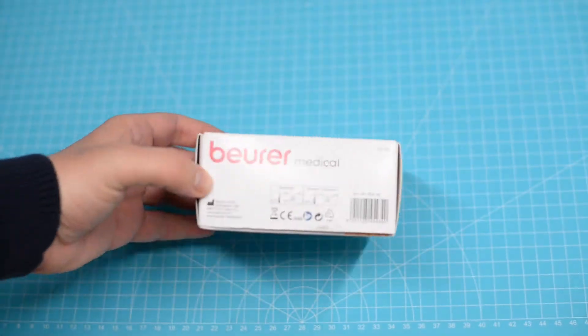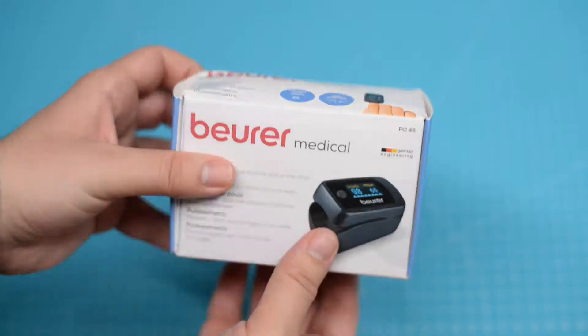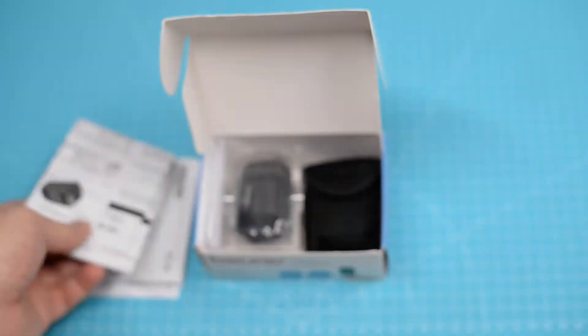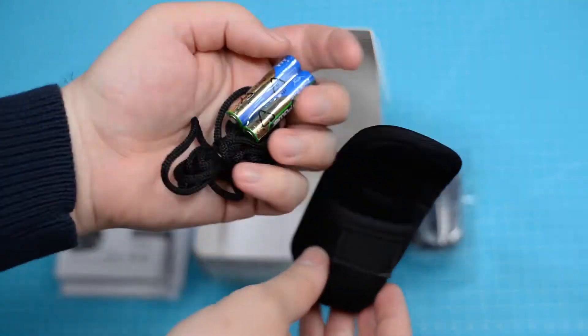Hi everyone, today we're going to look at Boiler PO45. The box has suffered a bit from the transport. Inside the box there are some manuals, a pouch, a strap and two AAA batteries.